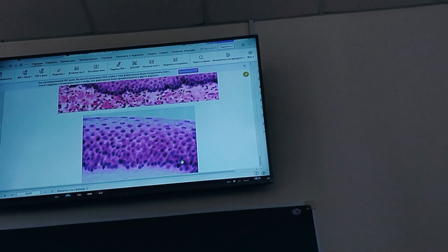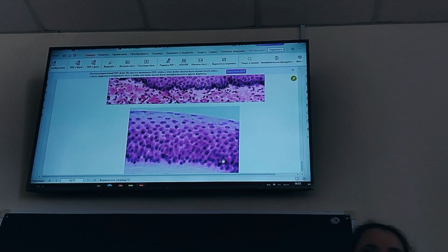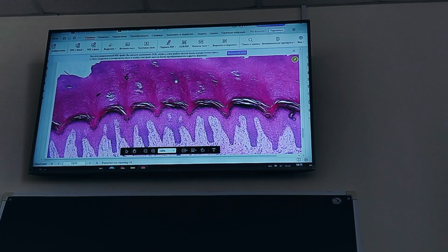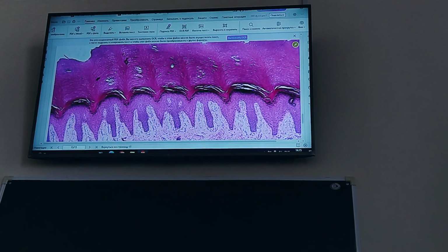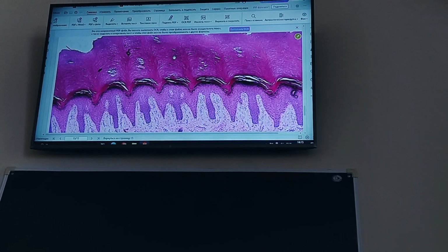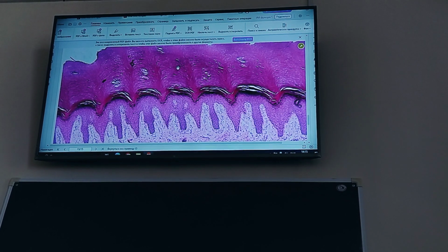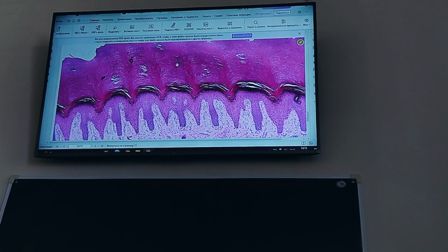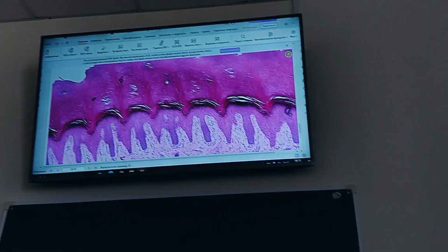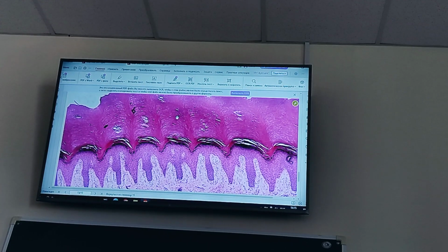They remain alive, preserve nuclei, and are flattened, in contrast to the previous case, where the superficial layer is cornified, totally dead corneocytes. That is all. This is just a general description with no specific information about functions or mechanisms. Only what is visible.